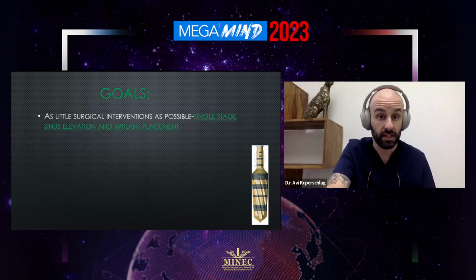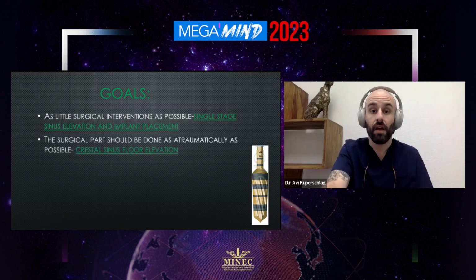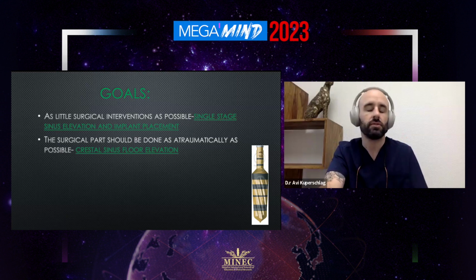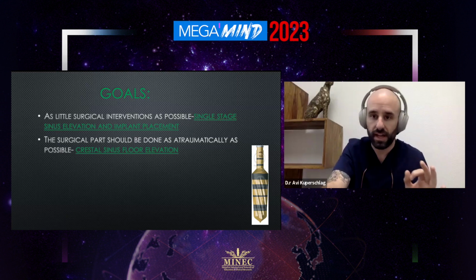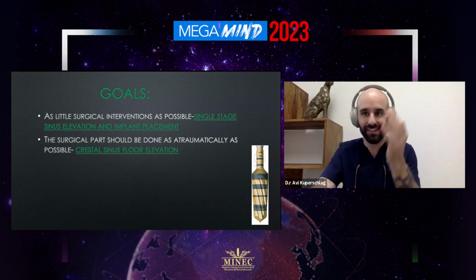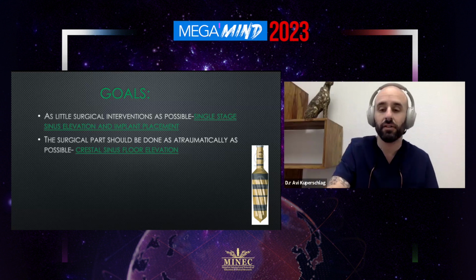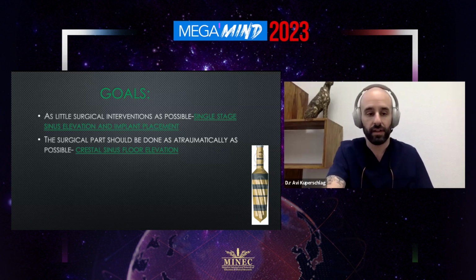And now that we're revisiting our goals, as little surgical intervention as possible: we did single stage sinus elevation with implant placement. It should be as atraumatic as possible, so we went for a crestal sinus elevation. And as I showed you, the flap is so small. Really, the patient went to work the day after, said, doctor, I think you lied to me. You didn't do anything because I didn't feel any pain. He only took 1 tablet of ibuprofen, an NSAID.